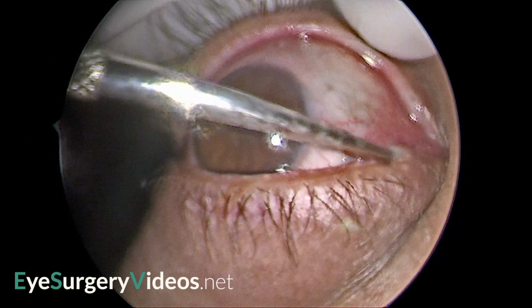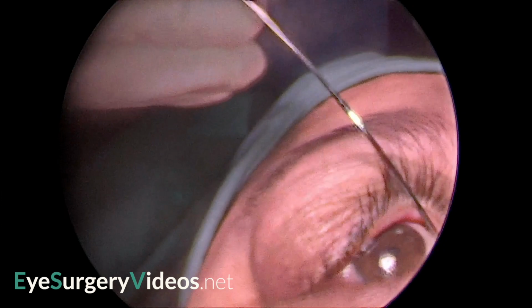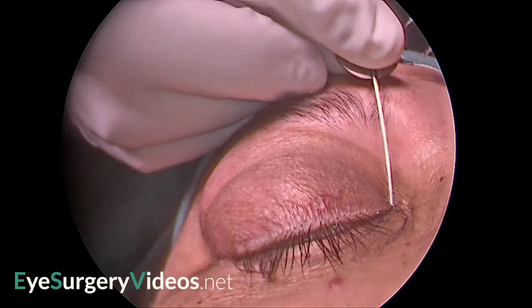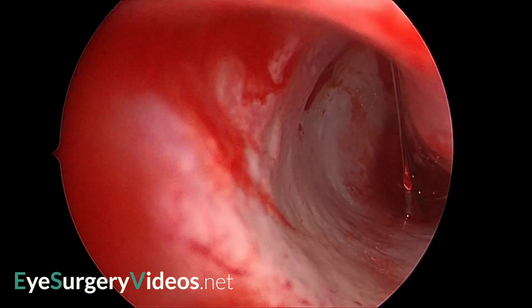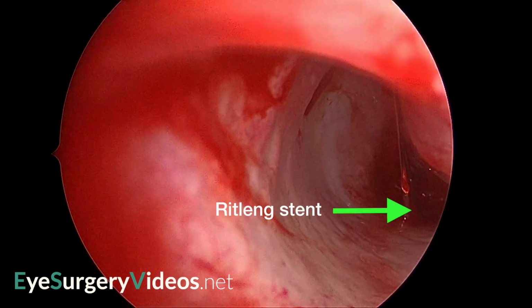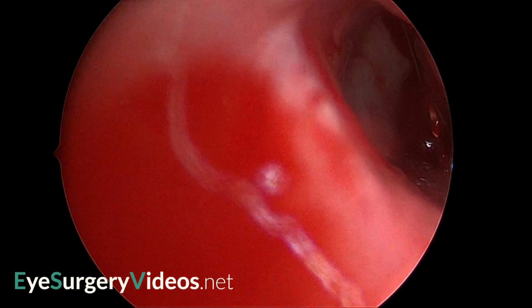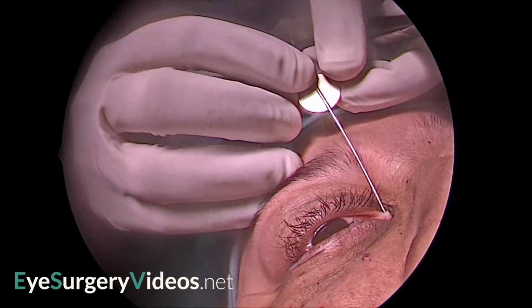The inferior punctum is dilated. The Ritleng introducer is gently advanced into the canaliculus, then lacrimal sac and nasolacrimal duct, taking care not to traumatize the lining of the nasolacrimal system or create a false passage. Instilling viscoelastic into the nasolacrimal system can facilitate the smooth passage of the introducer. The introducer is rotated so that the lengthwise slit can be seen facing anteriorly.